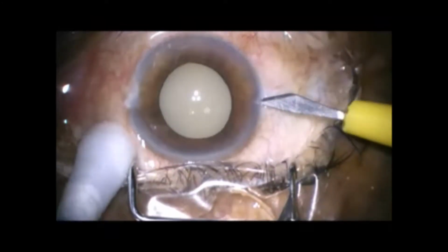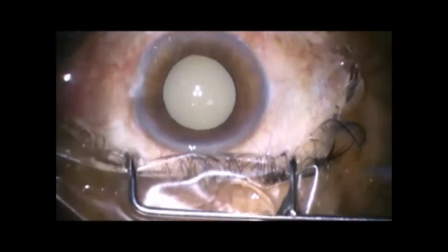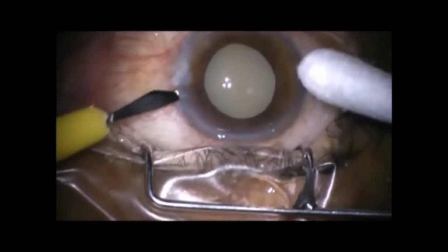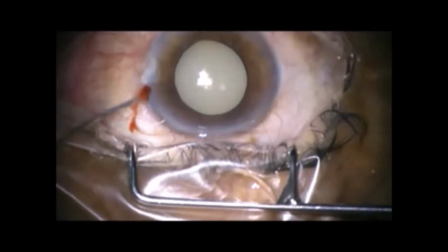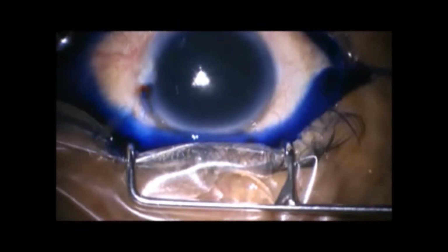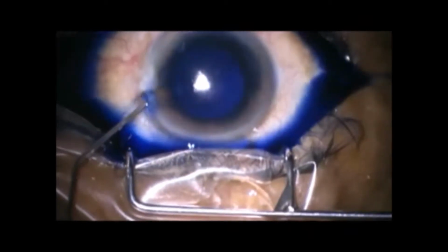Our surgical technique is as follows. Two adequate side ports are created. 0.1% trypan blue dye is injected into the anterior chamber to stain the anterior capsule. After a few seconds, the dye is washed off the anterior chamber.